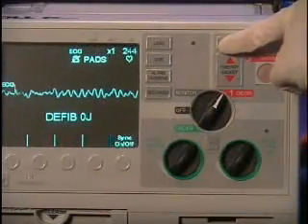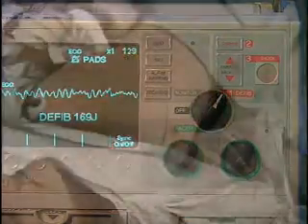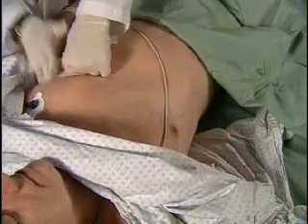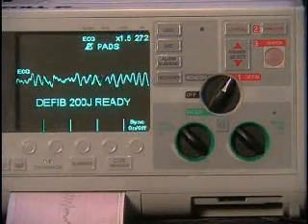When using the manual mode, the charging and discharging is fully controlled by the operator. In advisory and semi-automated modes, a sophisticated algorithm determines the need for a defibrillation shock and prompts the operator.